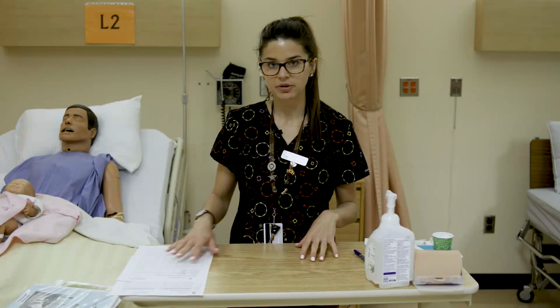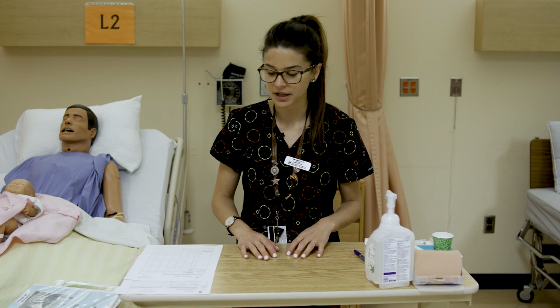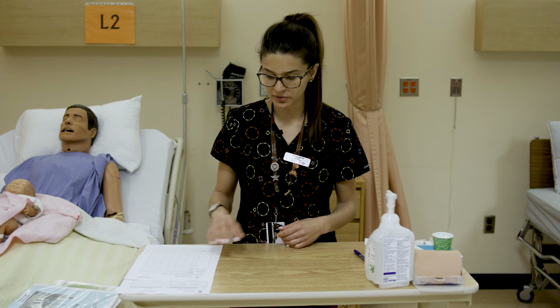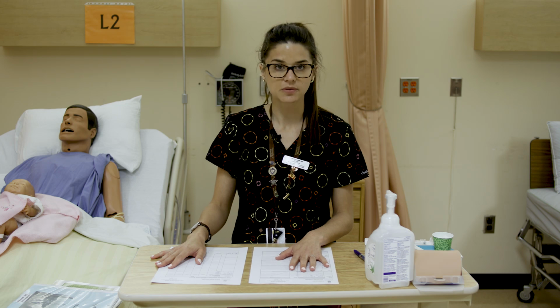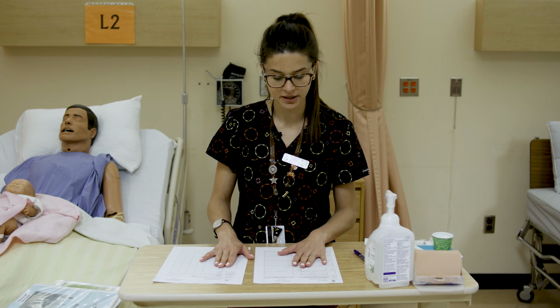Okay, so now we're going to be going over giving an IM injection, how to prepare it, and then the different routes or sites for administering it. So we'll start with the preparation as always, and we're going to do our checks. So we're going to review the physician's orders again with our MAR and make sure they're correct and accurate.